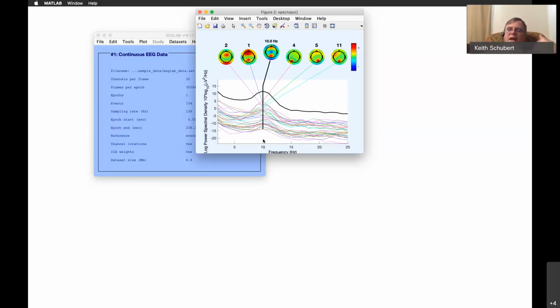Once we have the ICA, I can then have these components, which let me see the actual activity in this kind of brain mode. And now that I know where it's happening, I can say, wow, there's a lot of alpha wave in the classification area when the person's trying to determine the square, things of that sort.